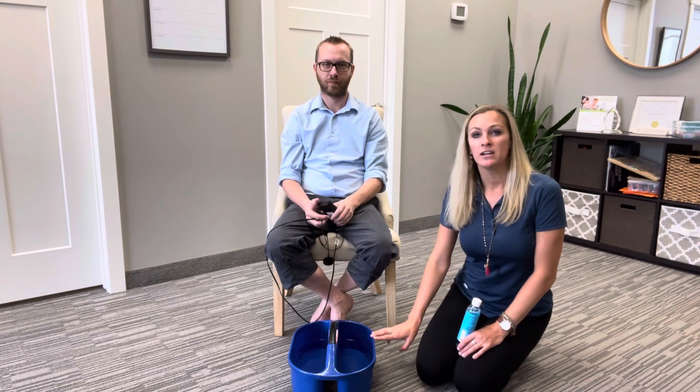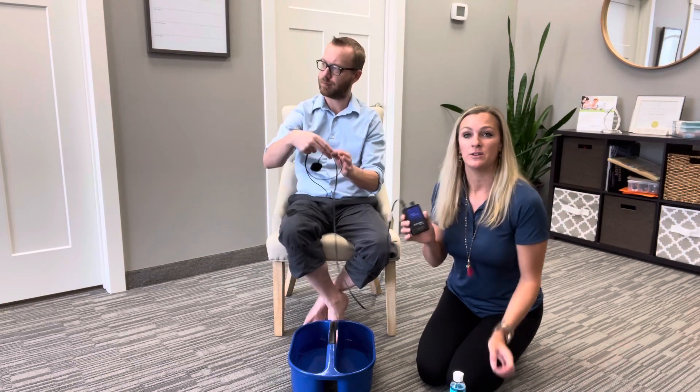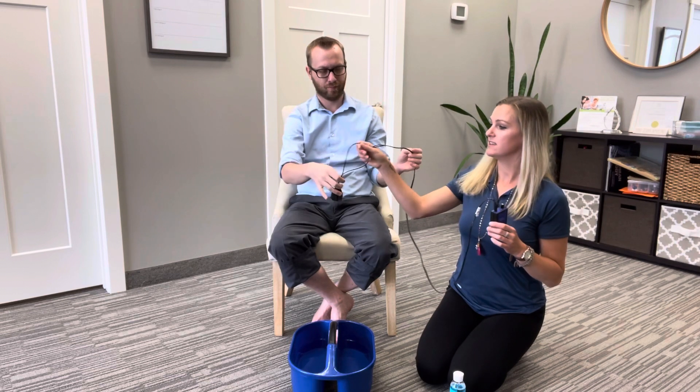This is called a Rebuilder. It kind of looks like a TENS unit, but it's different because this is actually going to help retrain your nerves to fire. A TENS unit actually blocks your pain receptors so you don't feel any pain.